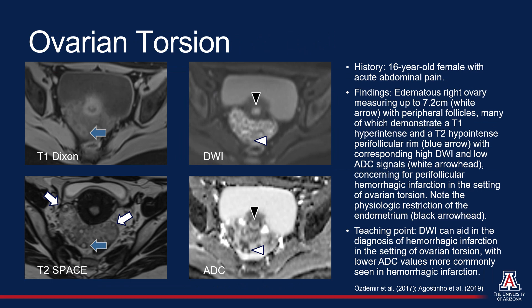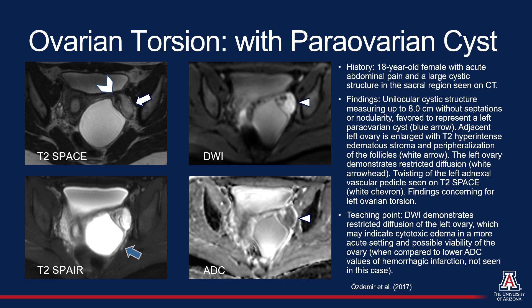Finally, in the case of ovarian torsion, there is research highlighting the utility of DWI and ADC in the evaluation of ovarian viability. In cases such as this one, there are areas of perifollicular restricted diffusion with particularly low ADC values concerning for perifollicular hemorrhagic infarction, a potentially poor prognostic sign. However, in this case, there is restricted diffusion of the left ovary, but the ADC values are not low enough to suggest hemorrhagic infarction. This restricted diffusion may be in the setting of cytotoxic edema produced by premorbid cells in a more acute setting, a finding which may indicate possible viability of the ovary and may significantly impact management.